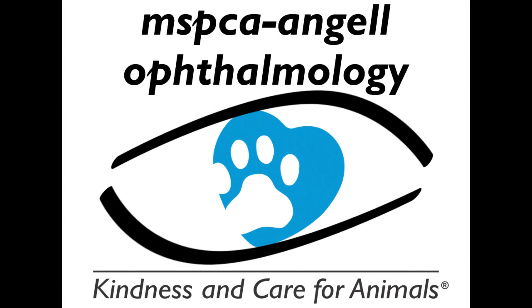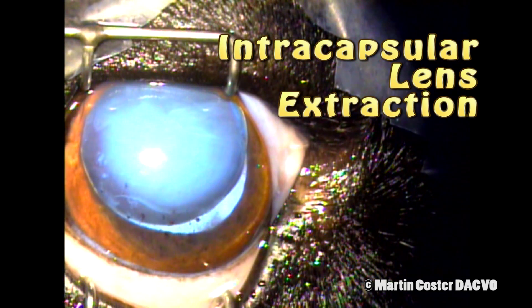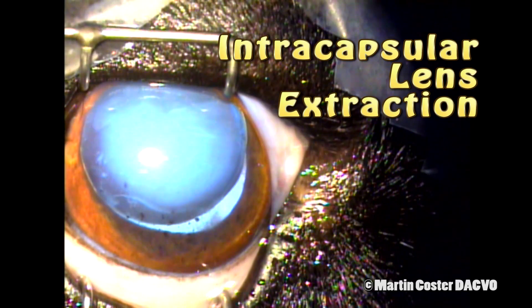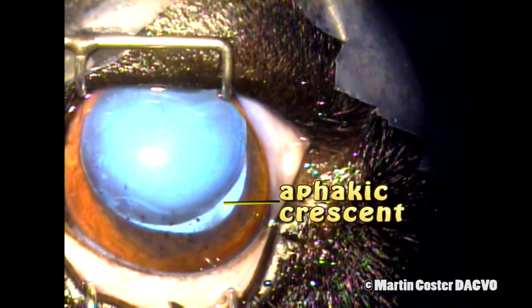My name is Martin Costa and I'm a veterinary ophthalmologist showing you today an intracapsular lens extraction in a dog. Here we see the lens in the anterior chamber of the eye. This patient has been anesthetized and aseptically prepared for surgery.